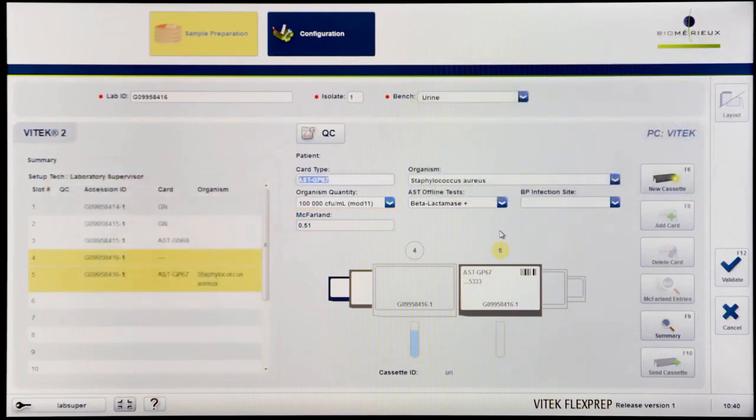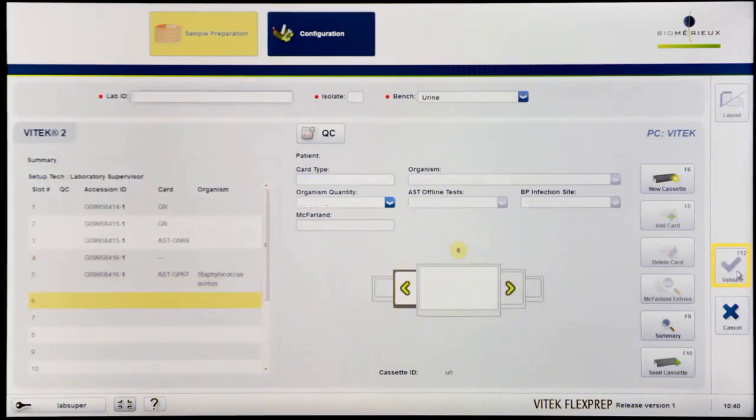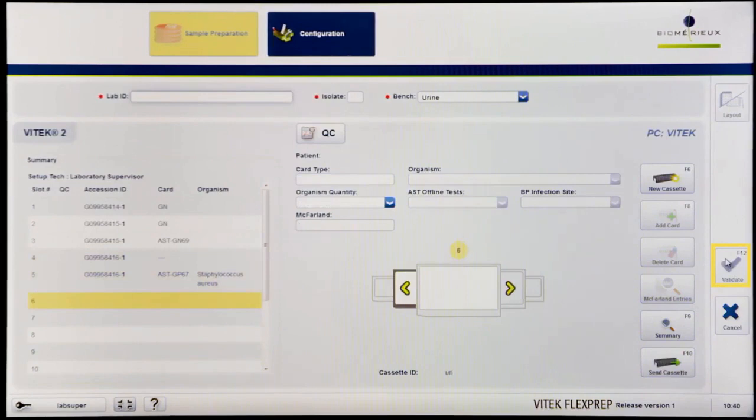Confirm all details for the isolate are correct and then click Validate or press F12 to save the information and advance to the next slot and begin setting up cards for the next isolate.